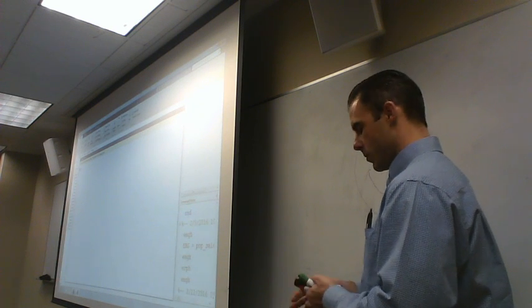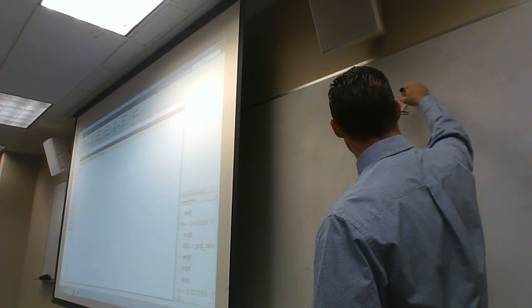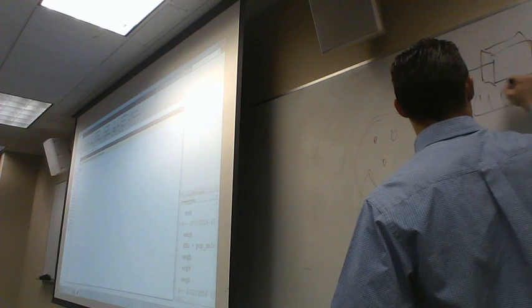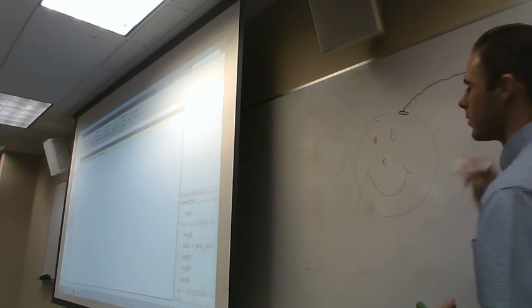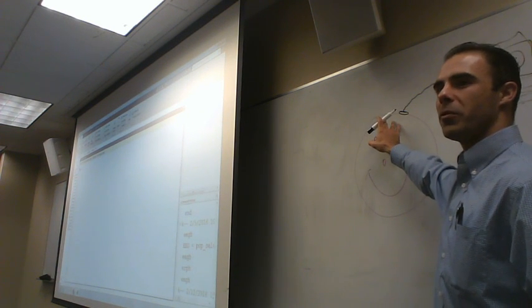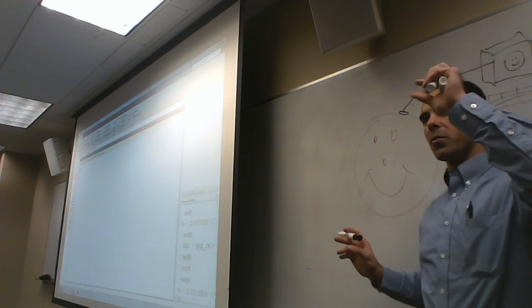We have an electrode that might be recording there, a little wire that comes out to your computer, and it shows that they're happy. This electrode is not actually on the scalp. We'll see this in more detail as we see that today. It's actually recording from the little space.